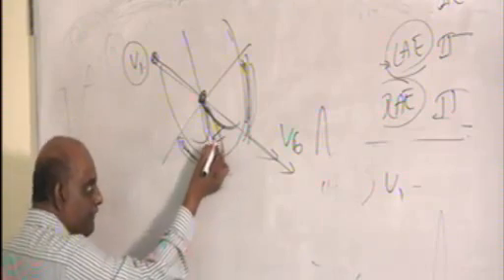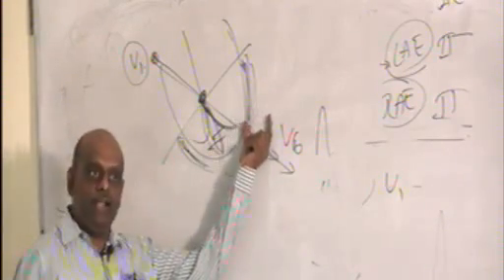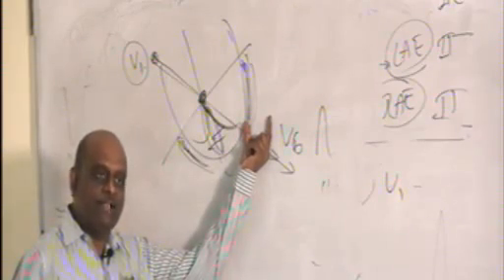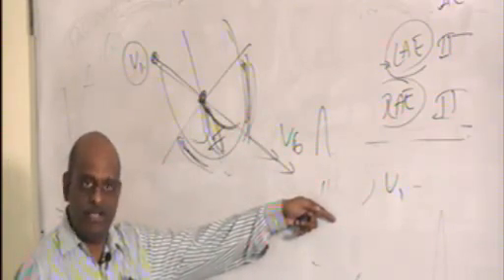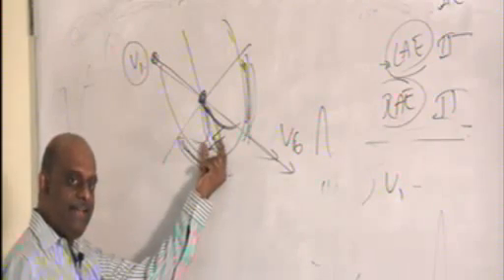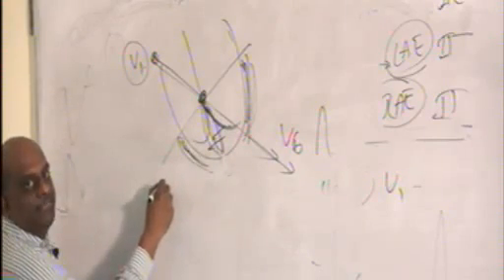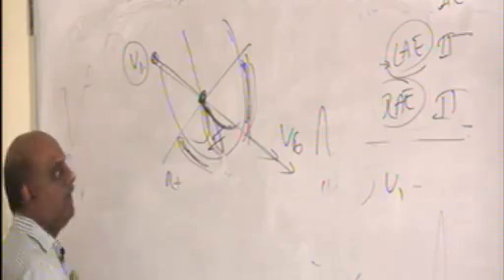And it will pass from left towards the right. So पूरा ventricular activity के वजह से electrical activity mean axis is going towards where? Right towards left. But interventricular septal activity from left towards right. इसलिए what is the effect of it?